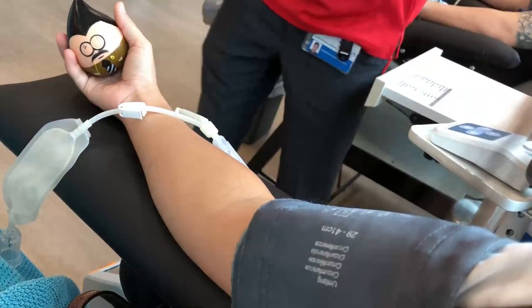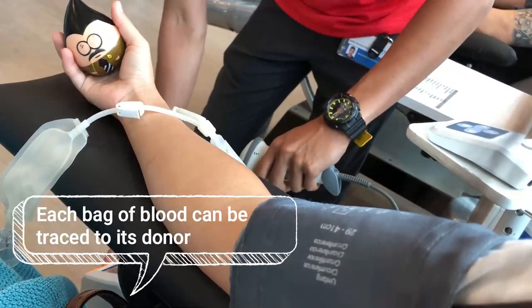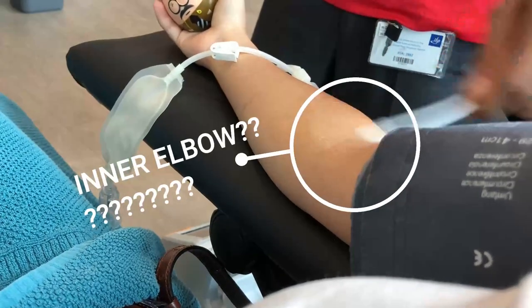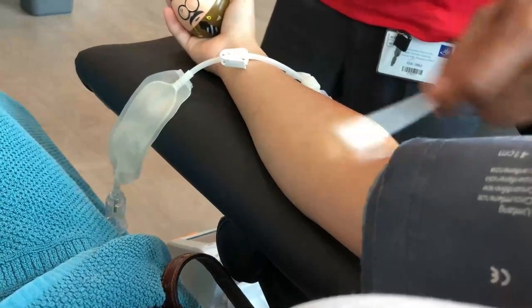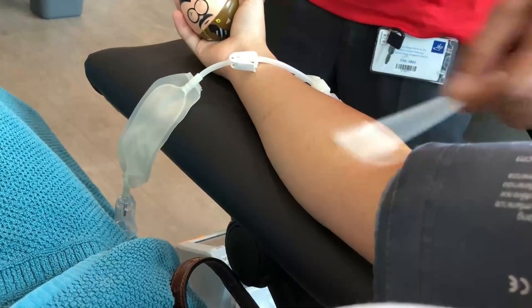He just put something on my arm and he's scanning labels. They label everything so that there's accountability. He's cleaning your elbow — what's the name of that part of your elbow? There's like a name for it. Anyway, they clean that part of your elbow because your elbows are dirty.